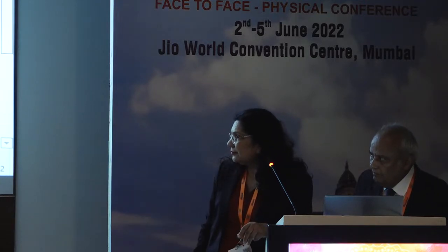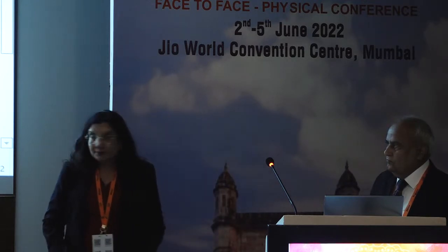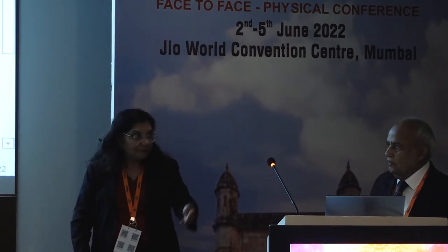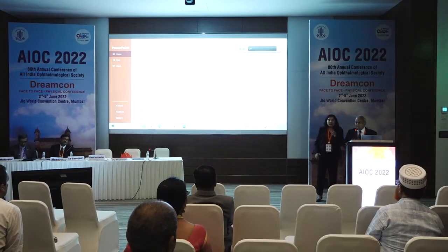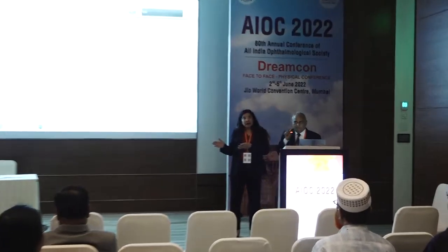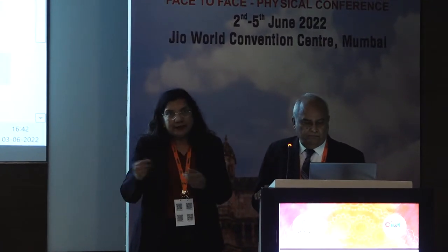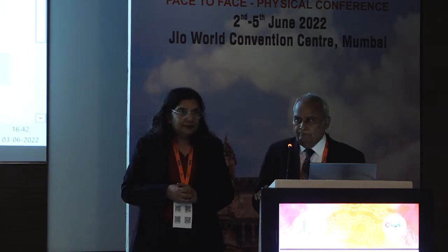Please, sir. If you have taken a temporal incision, I will prefer to suture it. So don't bother whether it is sutureless or with suture. You should suture. We have not seen any infection even with temporal incisions, but the problem there is not because of your incision. You have ended up doing a temporal incision because there was a problem, because there was a bleb superiorly. Otherwise, you wouldn't do temporal. So there, anyway, the conjunctiva has a problem.